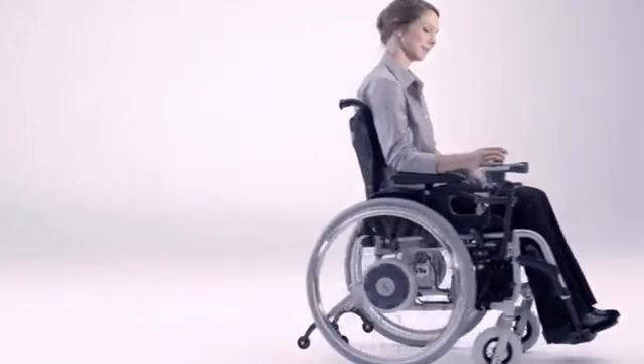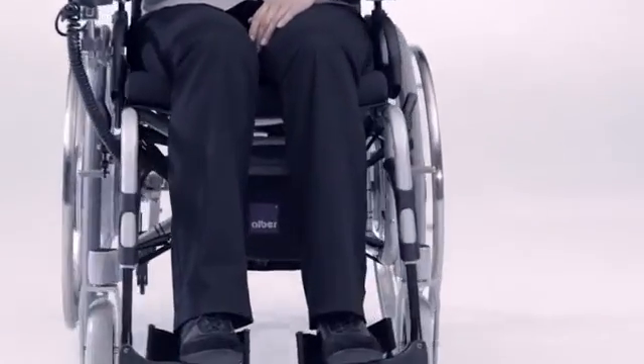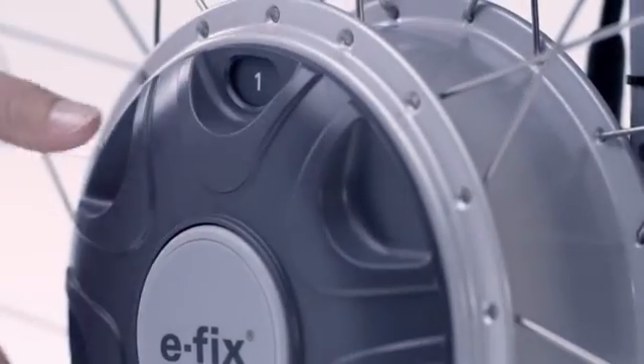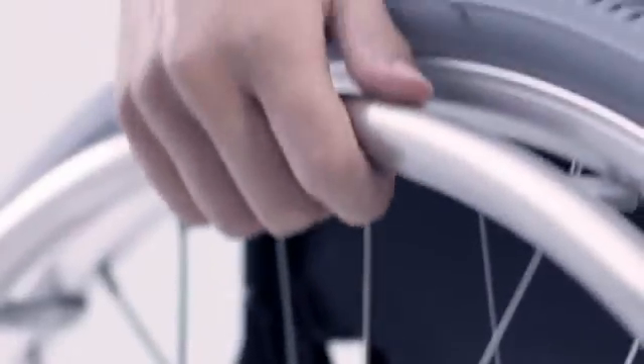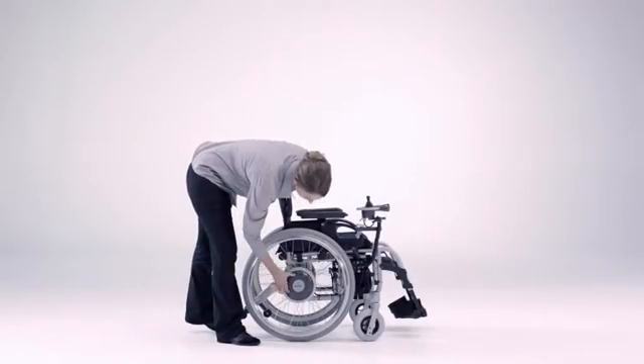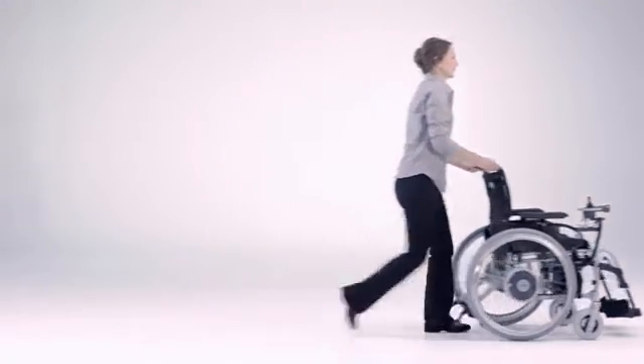Controlling the drive is child's play. The drive wheels are very easy to couple up or uncouple, so you can push by hand if you wish. Or your carer pushes the wheelchair using the handles.